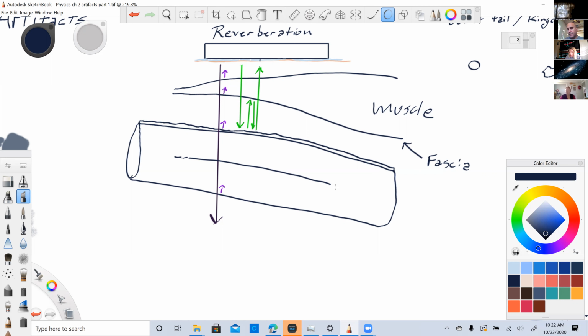But why does this happen? The machine thinks that this happened. Let's see, I'll put my blue arrow all over it. It thinks that is what happened, but it's wrong. What actually happened is it takes time for the reverberation echoes to bounce back and forth like that.